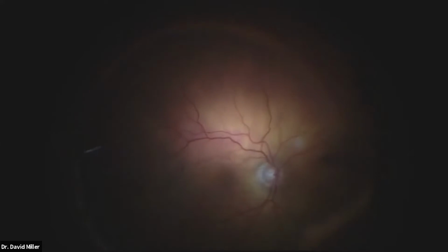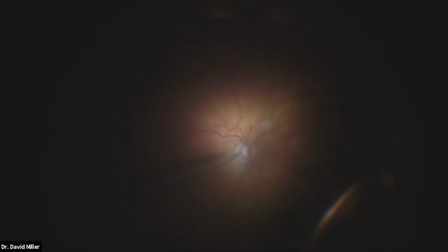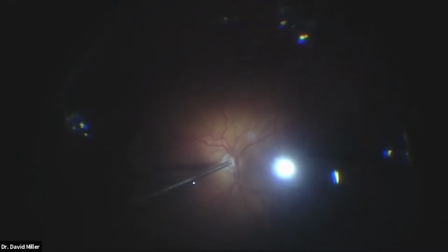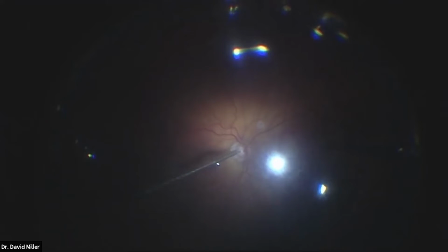So we'll go to air now. You can see the retina is flattened largely already. I was sucking out kind of thick subretinal fluid at the start there, and I'll do that first under fluid. So then I flip over to air. Now here comes the air bubbles. We're just going to drain over the optic nerve until the fluid reaccumulates near that retinotomy site. As the fluid is accumulating posterior, the retina will elevate itself around the retinotomy, giving me a nice pocket of fluid to aspirate again through the retinotomy site.